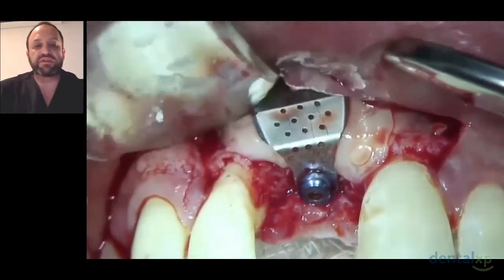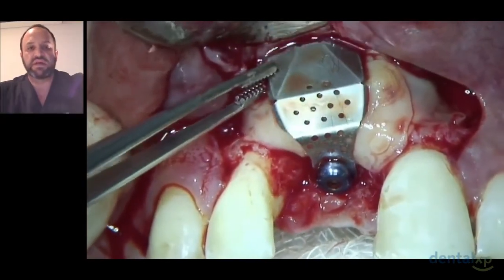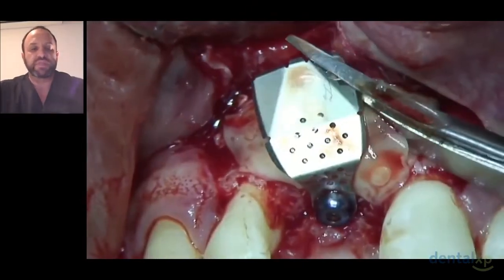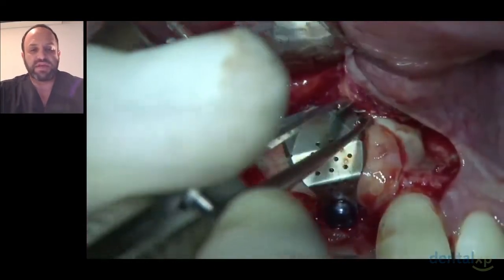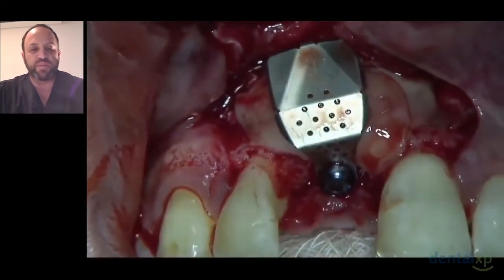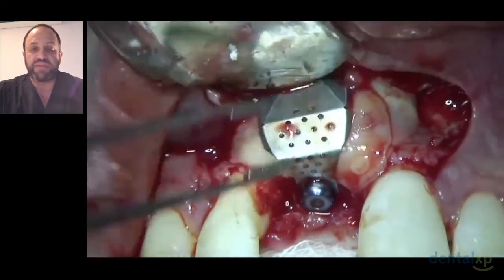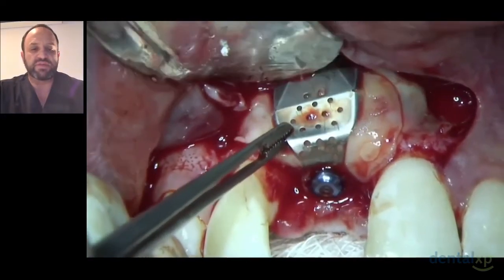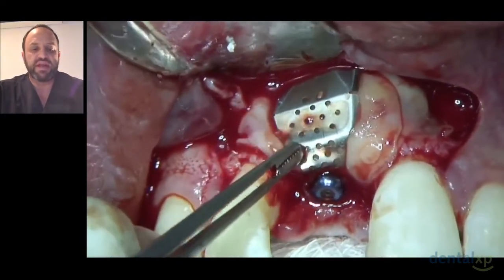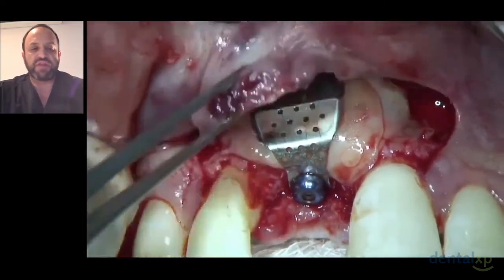And the fact that everything's going to stay there allows us to get everything in position. Because of the anterior nasal spine, I'm just cutting that small piece away so that everything sits a lot better. And you can also bend this into position nicely. So you can see here just a little bit of bending it into position so that it sits nicely and holds everything in position the way it should. So really a very, very nice membrane.